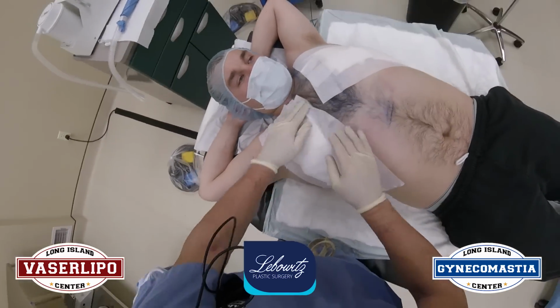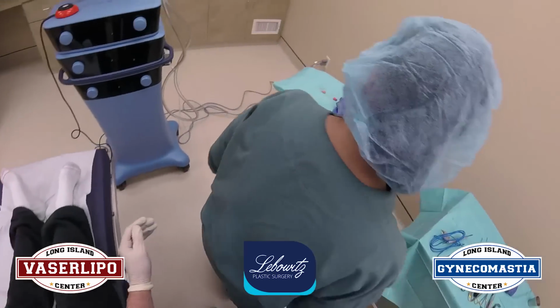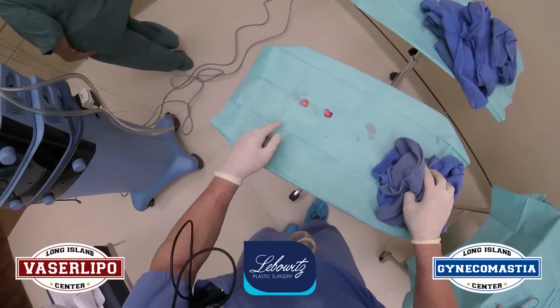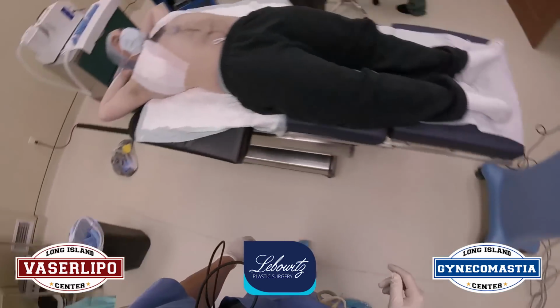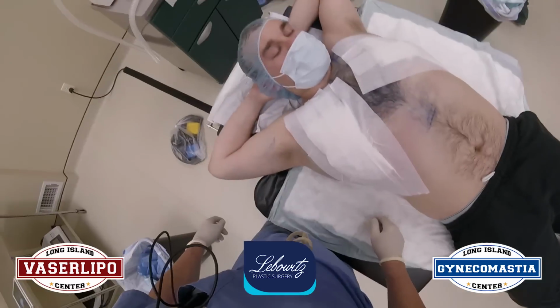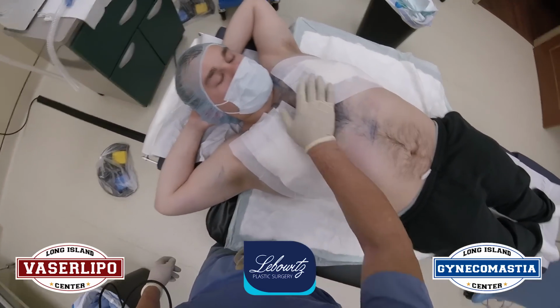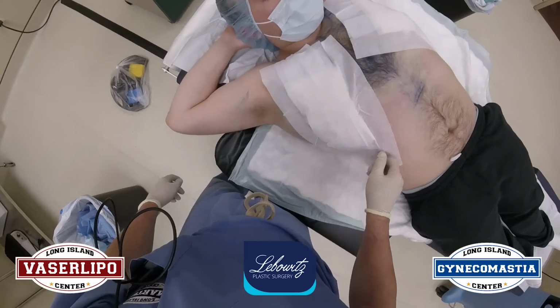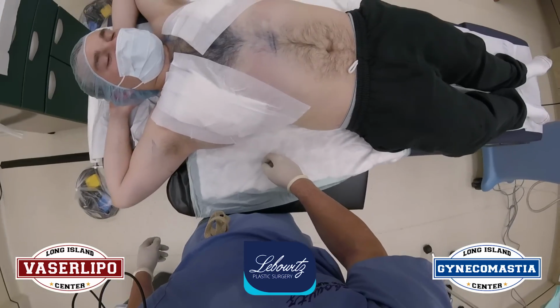So we're done with the procedure. Everything went great. Then these are the two glands that we got out after whittling it away. Tiny, tiny glands out of a teeny incision. And I only put in just a couple of stitches, and he's going to get an excellent result. We're going to put on a compression garment on him right now and put him into the recovery room, and he's going to drive himself back home. He lives about 2 hours away.